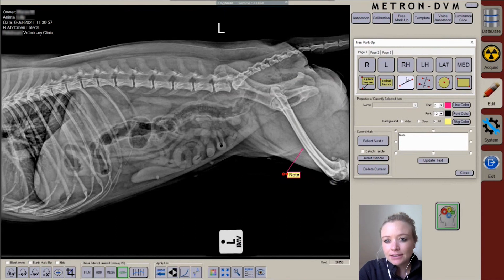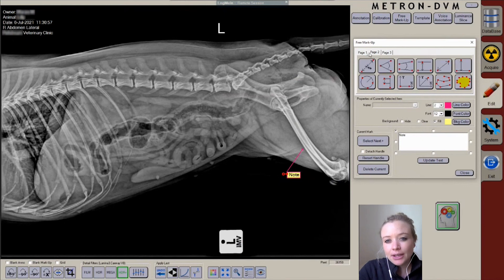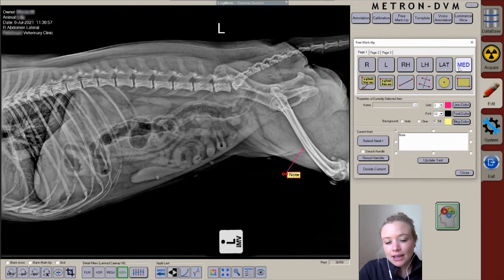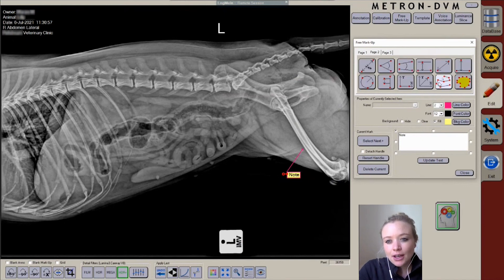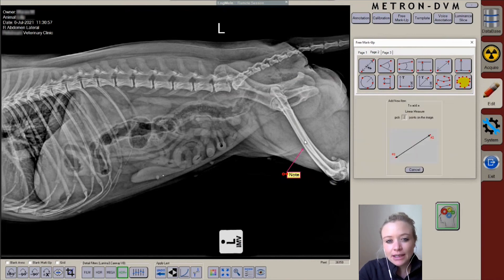There are various drawing tools available. We can draw parallel lines, squares, and put in labels. We can label lateral and medial in an image. In terms of measurements, we find these here. We get a linear measure, which will not be available unless the image is calibrated.